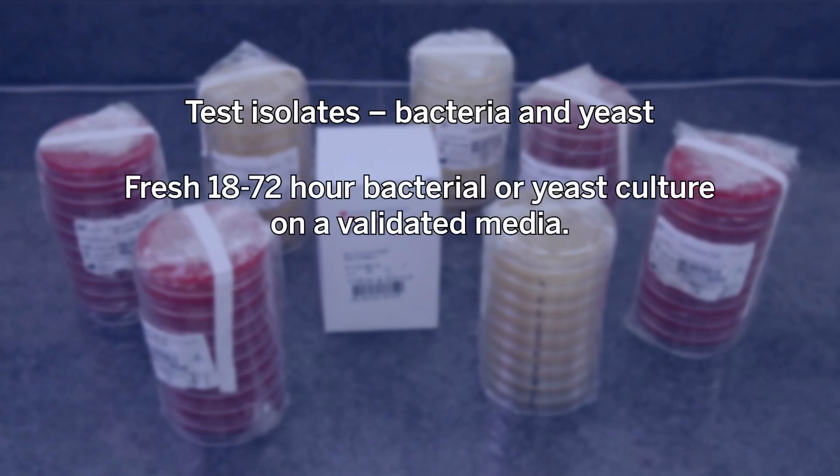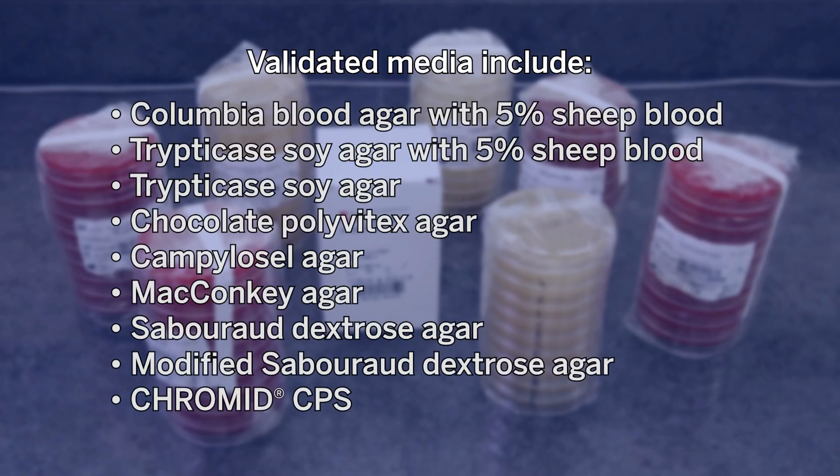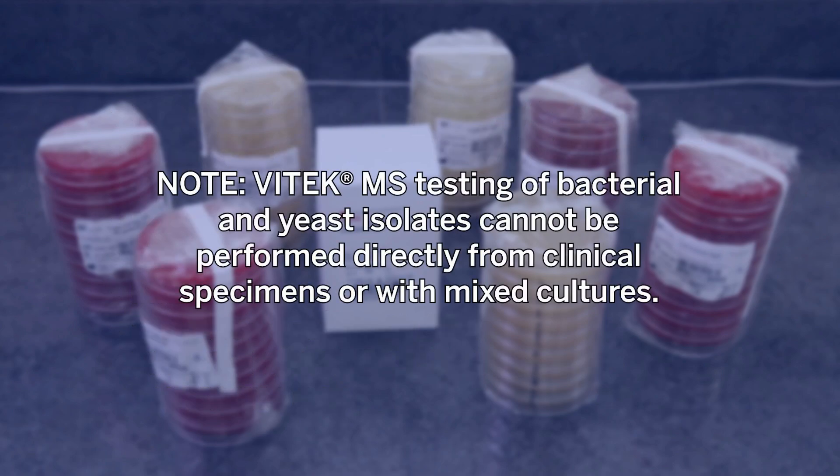Fresh 18 to 72 hour bacterial or yeast culture on a validated media. Validated media include Columbia blood agar with 5% sheep blood, trypticase soy agar with 5% sheep blood, trypticase soy agar, chocolate poly Vitex agar, Campylocell agar, MacConkey agar, Sabouraud dextrose agar, modified Sabouraud dextrose agar, and Chrome ID CPS. Note: Vitec MS testing of bacterial and yeast isolates cannot be performed directly from clinical specimens or with mixed cultures.